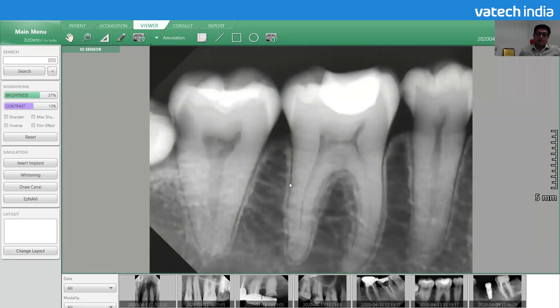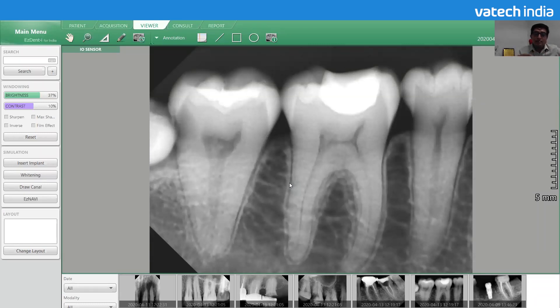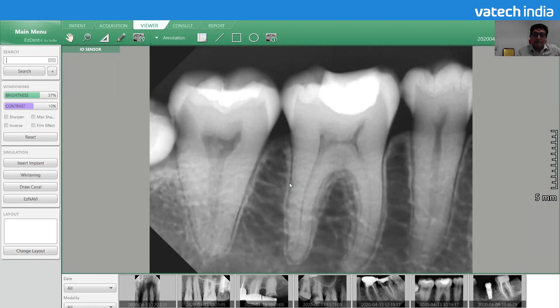For intra-oral X-ray images, if you don't have a known object, use the sensor-based calibration method. Remember: intra-oral X-ray images should be calibrated separately. Each X-ray image must be calibrated before taking a measurement — calibrating one image does not calibrate another. Follow this practice on every image if you want correct measurements.